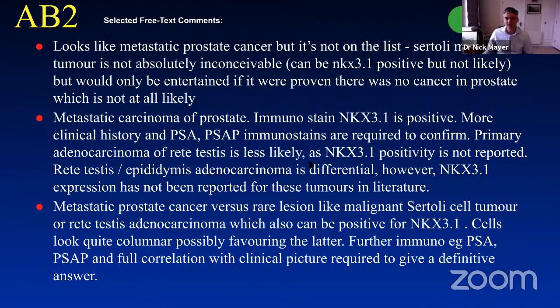And although this person didn't think rete testis adenocarcinoma should be NKX3.1 positive, there is a paper which I'll give you the reference to at the end of this, which had, these are extremely rare, of course, some positivity for NKX as well. And it can also stain background Sertoli and Leydig cells in the normal testis.